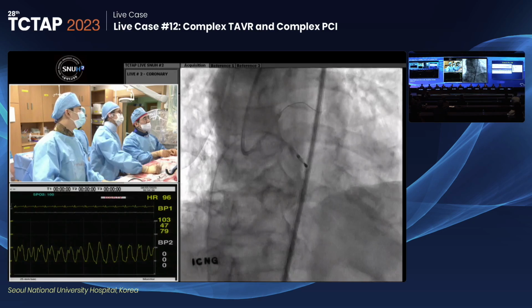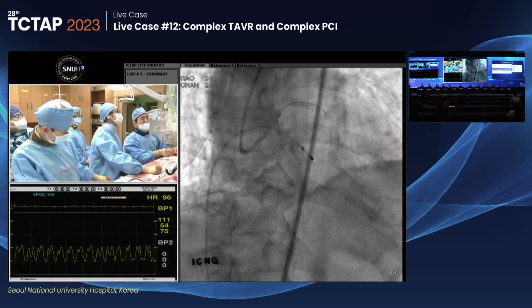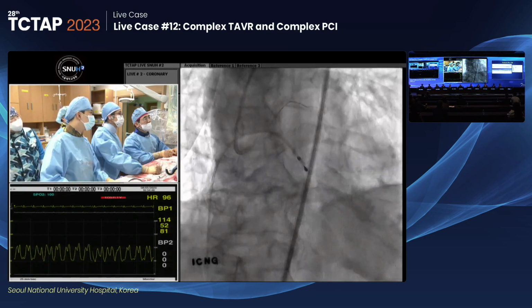The wire is kind of used up a little bit. Did you get a fresh one? Yeah, the tip is beat up. It wouldn't even go through the die, so it must be beat up. A new wire.